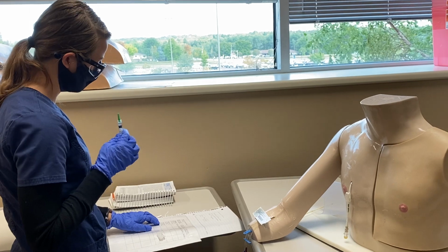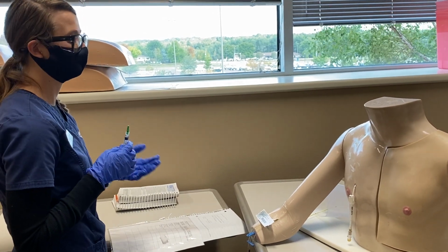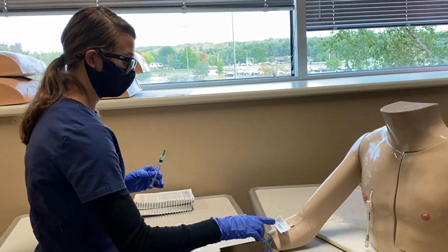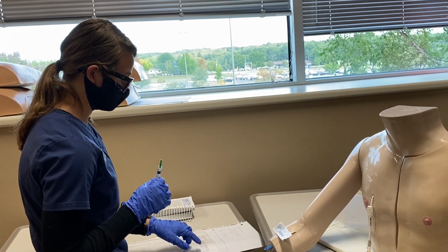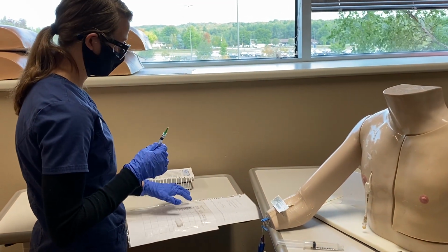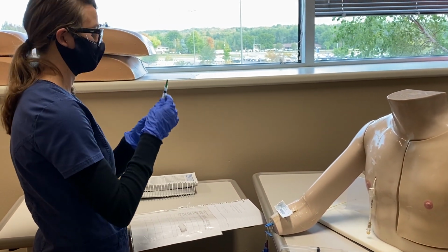I'll be giving it IV push every 3 hours for pain. He has yet to receive it today, so the time is now. So I have Bob Owens. Date of birth is 9/22/1933. He is allergic to morphine, so we're giving hydromorphone today.